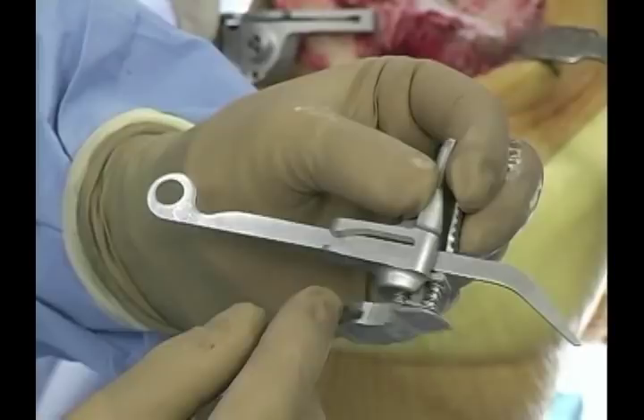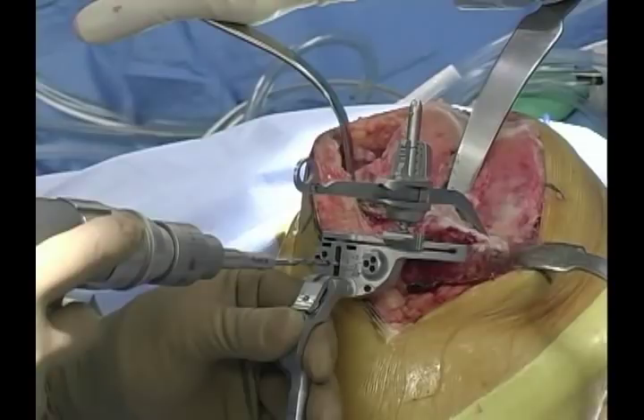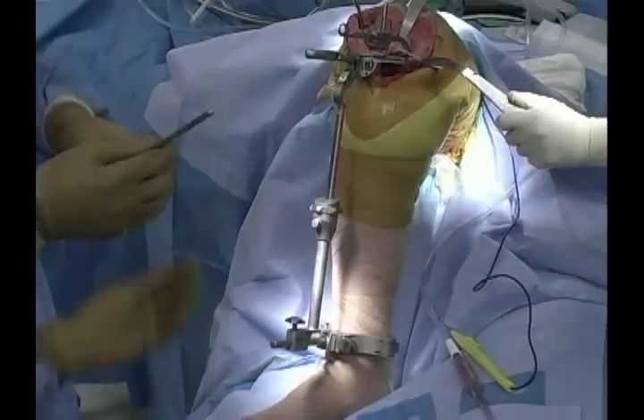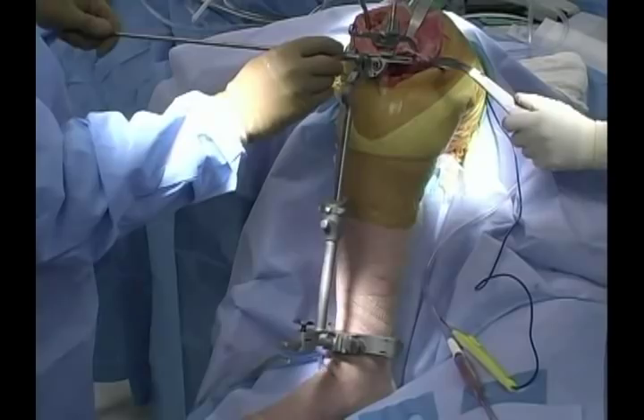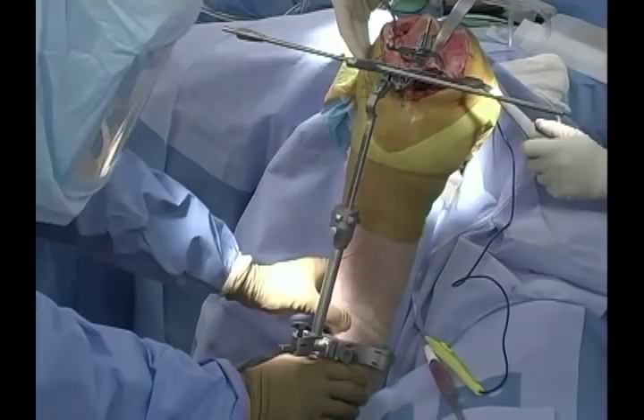The first pin will be a central pin in the central large slot. This slot allows the block to move up and down before final pinning, but stabilizes the cutting block on top of the tibia. This tower allows me to apply a transverse rod through the hole, giving me a long line of sight to estimate a 90 degree orientation to the tibial crest or within the anatomical axis, whichever you choose.